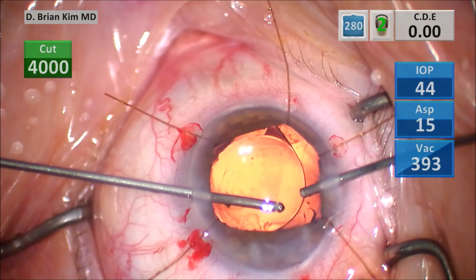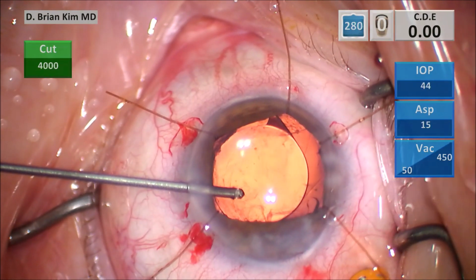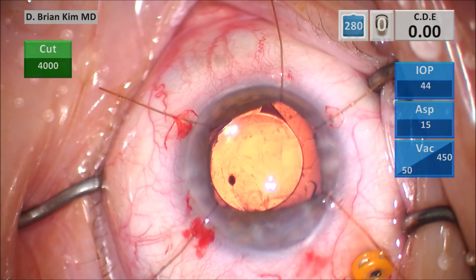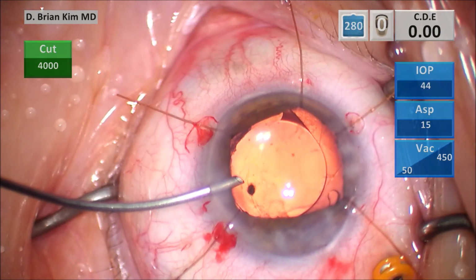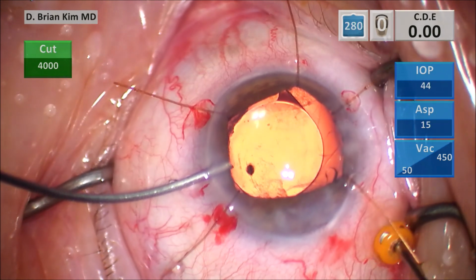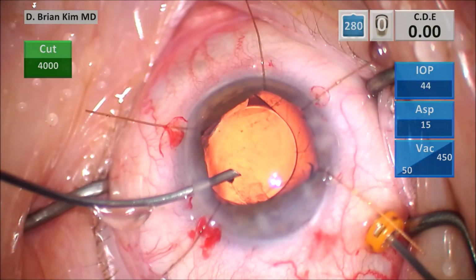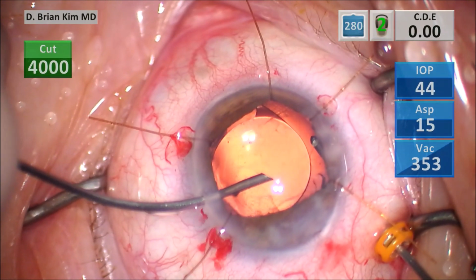And as I did the vitrectomy through the trocar, immediately the lens deepened in position and it started to center even better. And as you see, I'm going to do some more vitrectomy here. And as you do that, you're going to see the lens actually centers even better as I go. So again, great retraction, great visualization because I use the iris hooks to help me see what's going on.